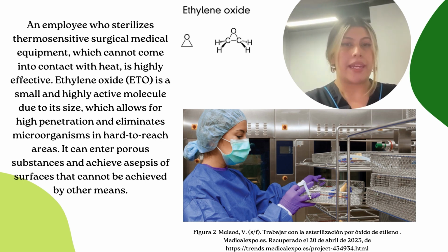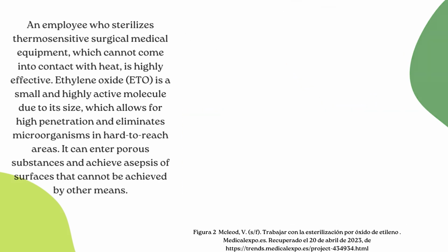Being a very effective method, ethylene oxide can be dangerous in the sterilization process since its toxic properties have been proven, due to high concentrations or due to frequent and prolonged exposure.